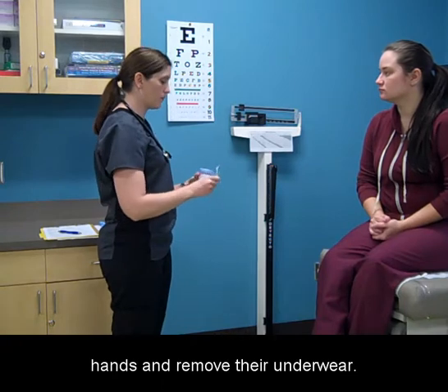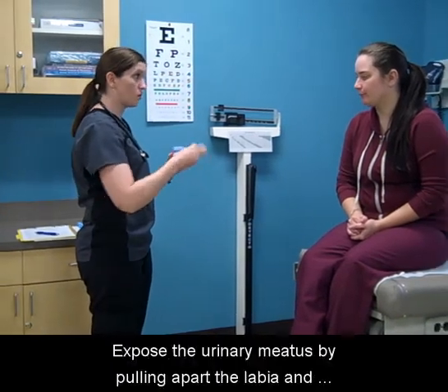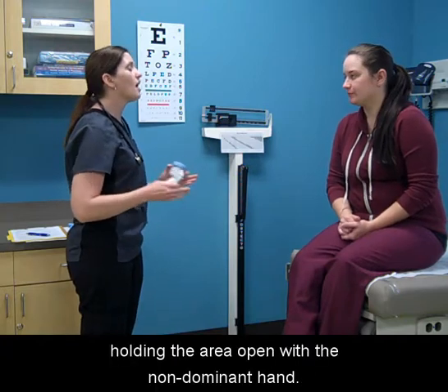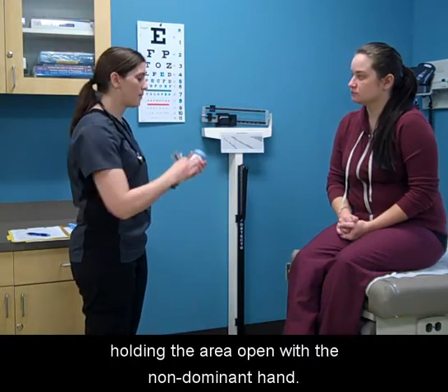Tell your patient to wash their hands and remove their underwear. Expose the urinary meatus by pulling apart the labia and holding the area open with the non-dominant hand.